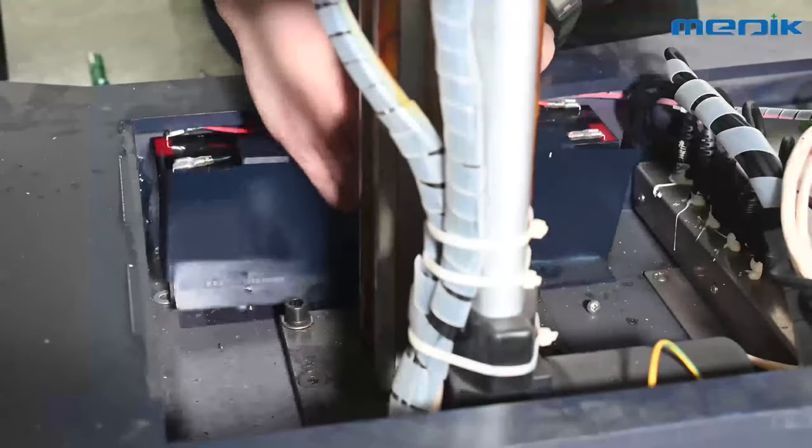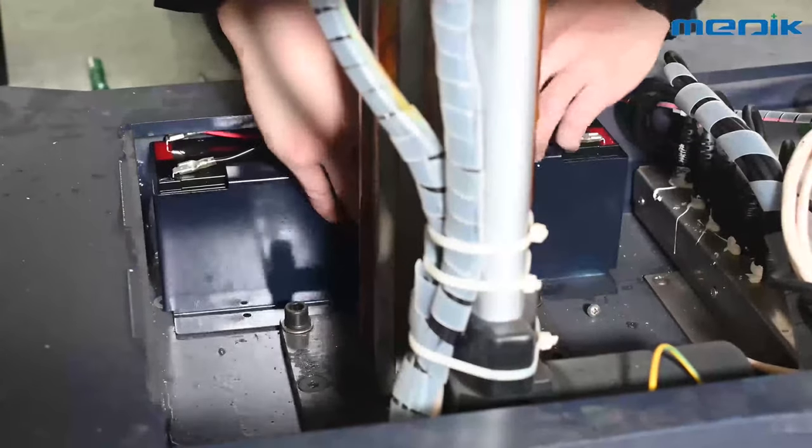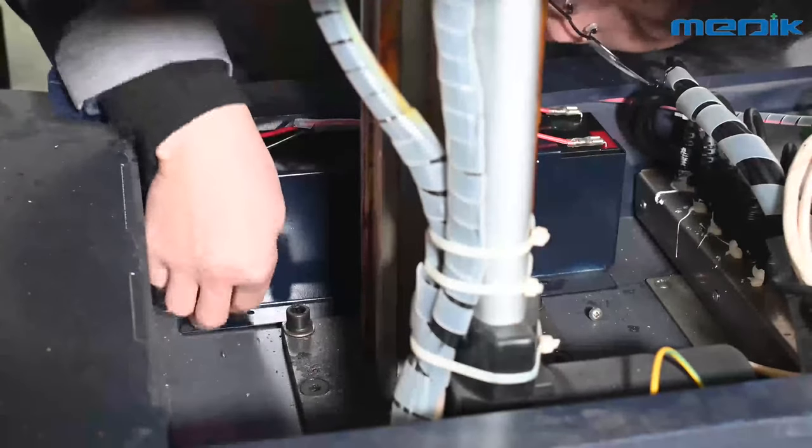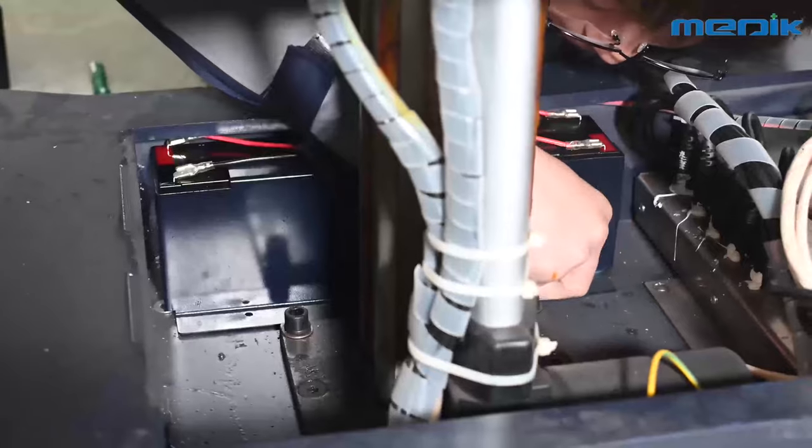Step 4: Fix the battery fence to hold the battery. Lay down the base cover and tighten the screw. Now you can operate the table with the new battery.